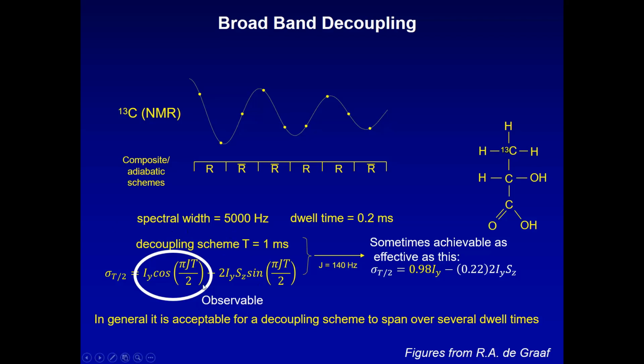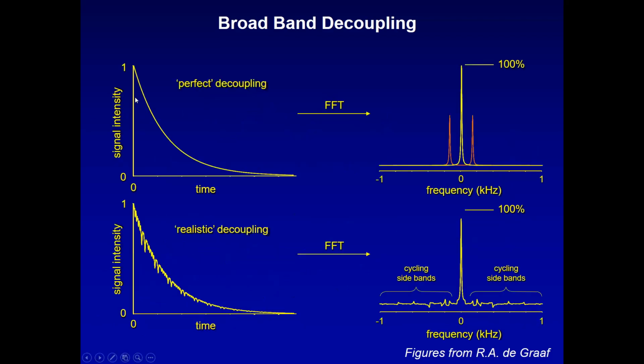So we want to see an in-phase component, not an antiphase, and we want it to stay in phase the entire time we're observing it. What I've described is perfect decoupling. Instead of having two off-resonance peaks oscillating around the rotating frame or the ideal Larmor frequency, we have just one nice peak in the middle. And that's what this representation would be.